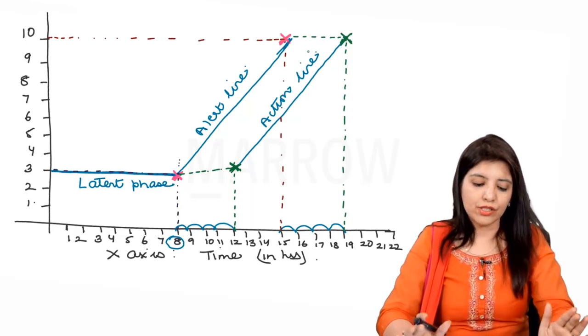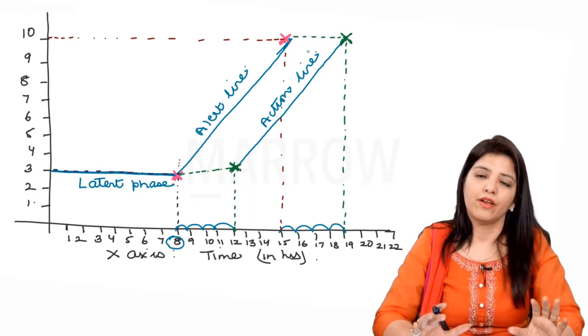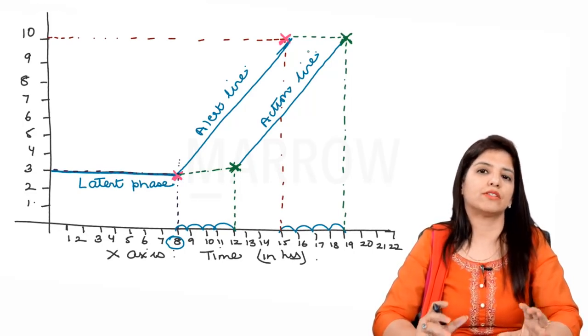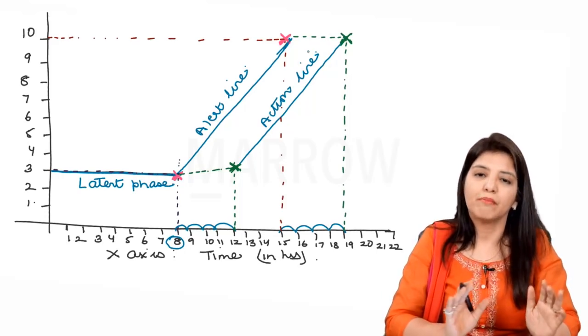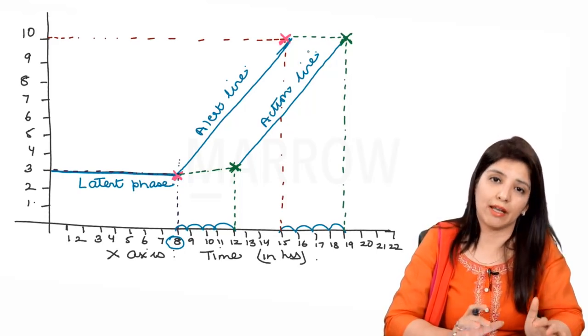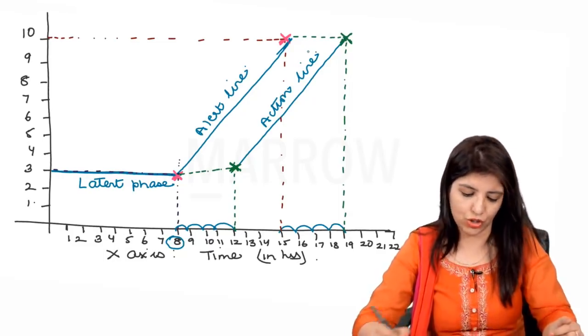Right? Now this is how you draw a composite WHO partograph. This is because in exams there are certain questions which are asked where you will have to draw it quickly and you will have to plot. But actually when you are conducting labor, in the labor room, this partogram will already be provided to you.